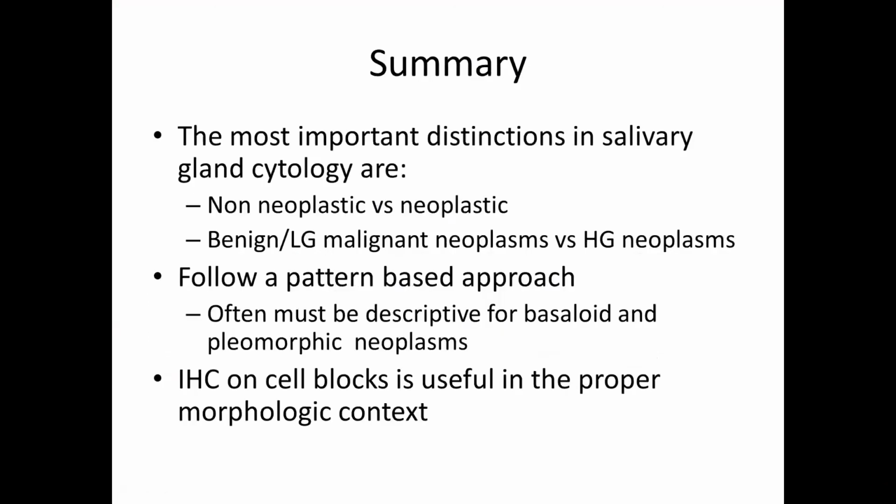I think in salivary gland cytology, the most important distinctions are between neoplastic and non-neoplastic on the one hand. And again, a diagnosis of malignancy isn't necessarily the most important thing. It's really the distinction between benign and low-grade malignancies on the one hand and high-grade malignancies on the other hand, because those are treated more aggressively.